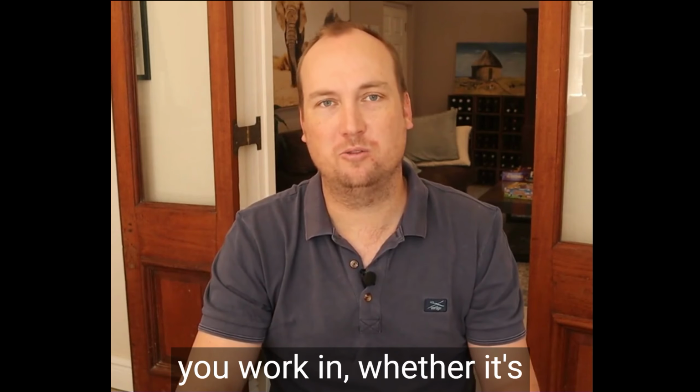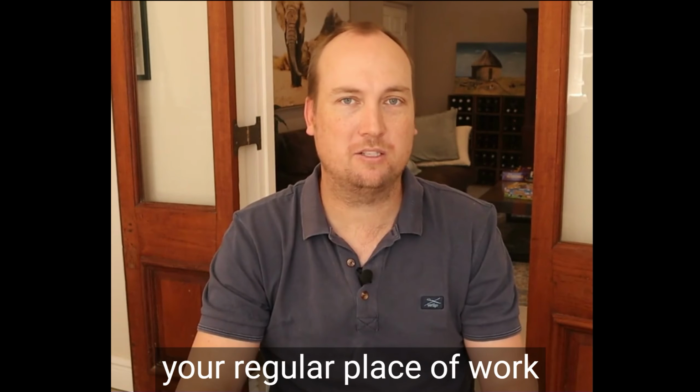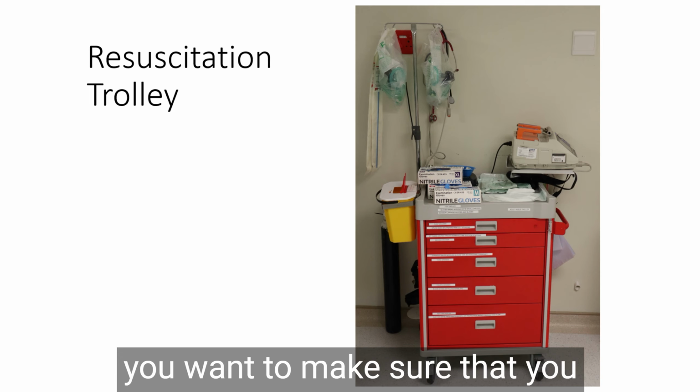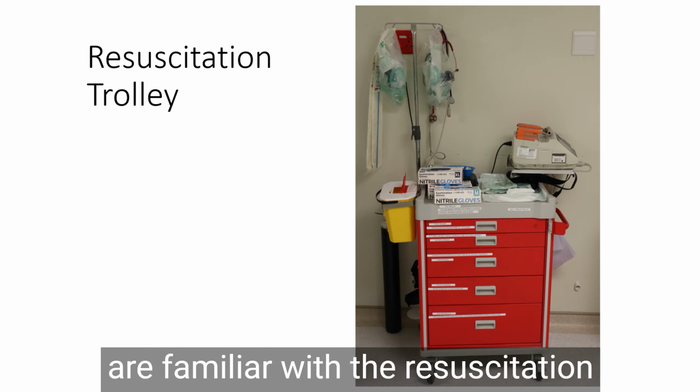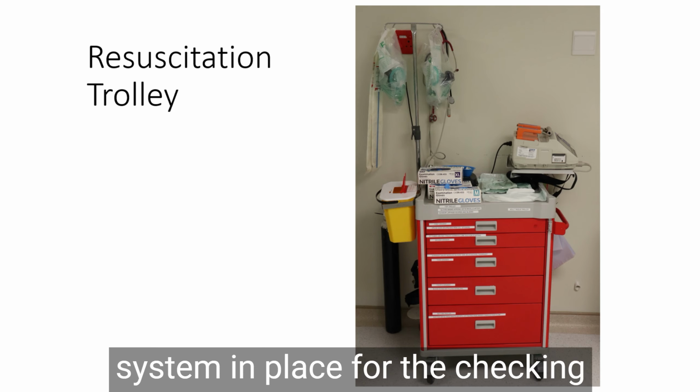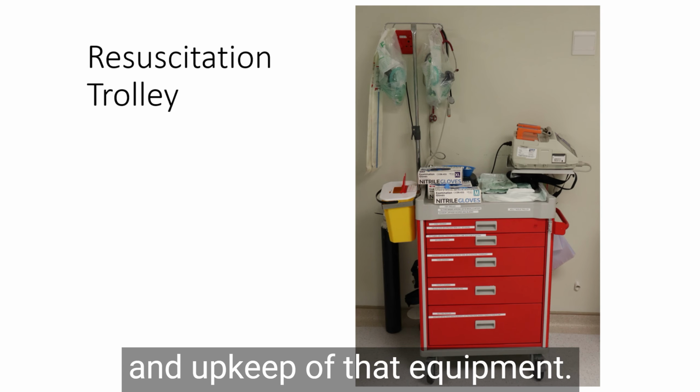Whatever theatre complex you work in, whether it's your regular place of work or if it's a new venue for you, you want to make sure that you are familiar with the resuscitation equipment available in theatre, and that theatre has a system in place for the checking and upkeep of that equipment.